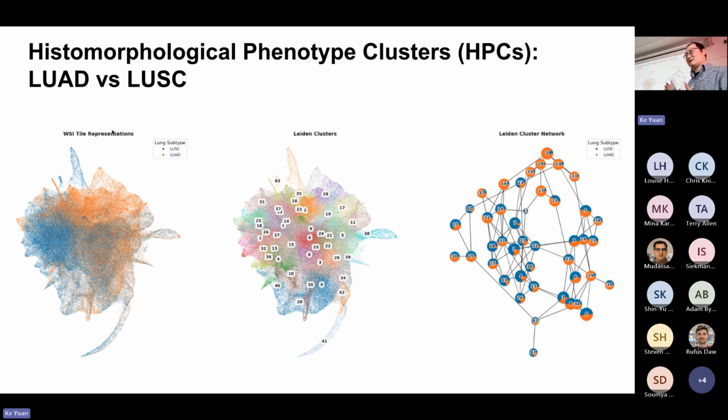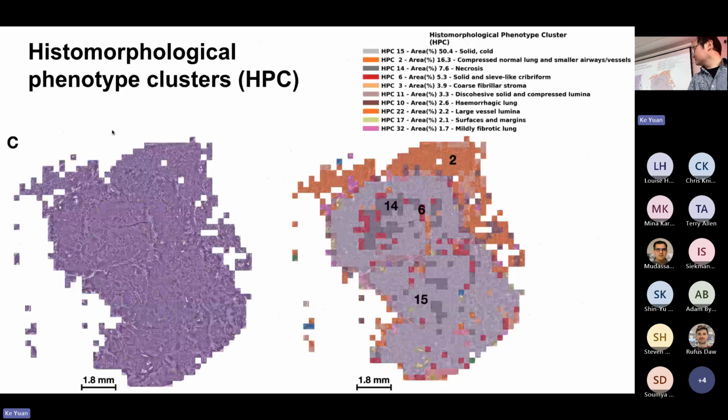And our data actually behave nicer than those, because we don't have really sparse signal in our neural network representations. They are very, very nicely behaved due to the self-supervised training objective function. So latent clustering behaves really well in this case. Once you do that, it's very easy to gain information from a single slide.